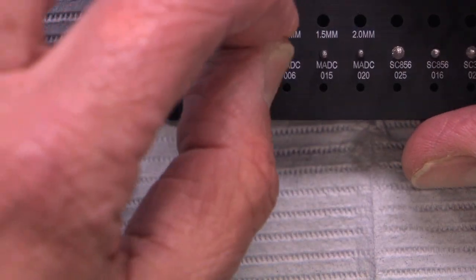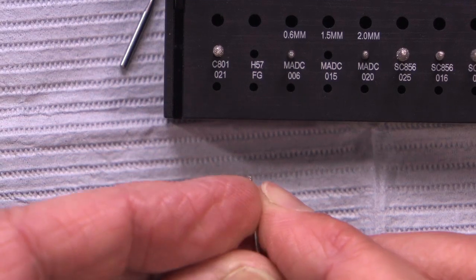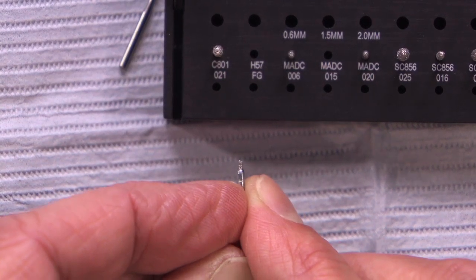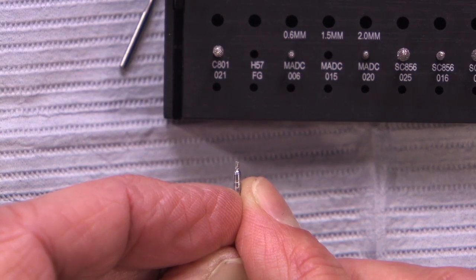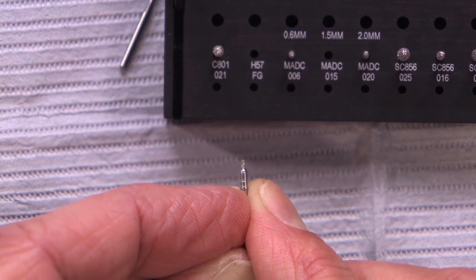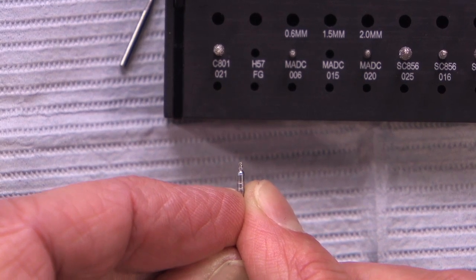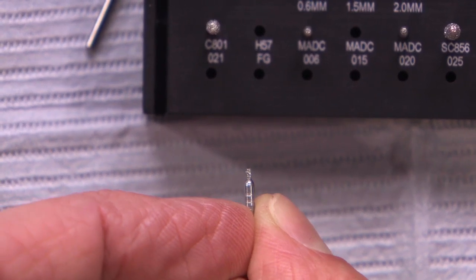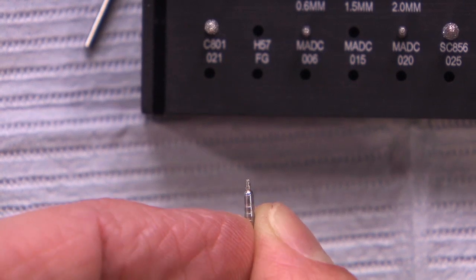But that's amazing. That's a very short cutting surface, very conservative restoration when you can do it at 6/10 of a millimeter. This is a 1.5 millimeter depth cut. This is what we use for any bilayered material like Lava, Procera, zirconia, PFMs, and I even use it for Emax because I like to be able to have an adequate thickness. The minimal thickness for Emax is 1 millimeter, and I feel more comfortable with it at 1.5 millimeters because it does have more strength at that point than it does at 1 millimeter.